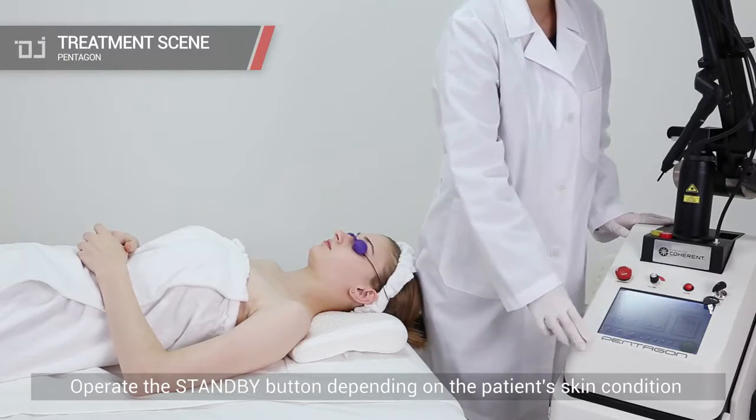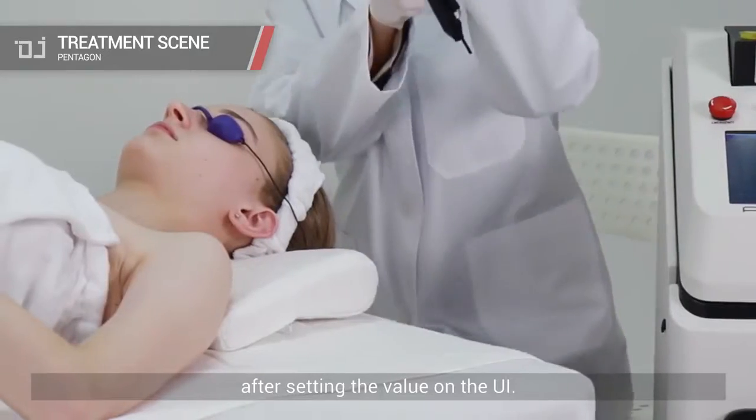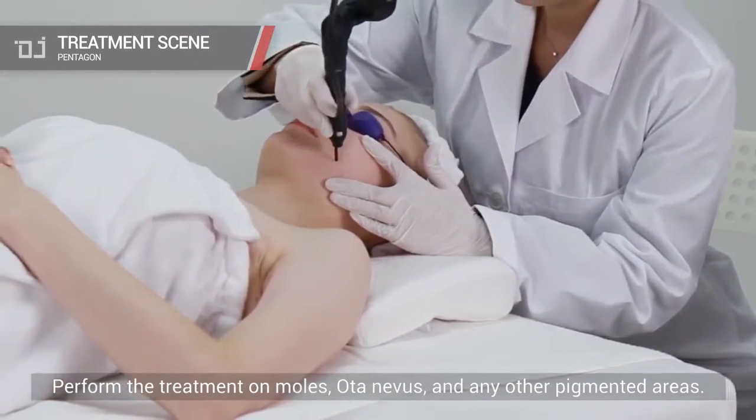Operate the standby button depending on the patient's skin condition after setting the value on the UI. Perform treatment on moles, ota nevis, and any other pigmented areas.